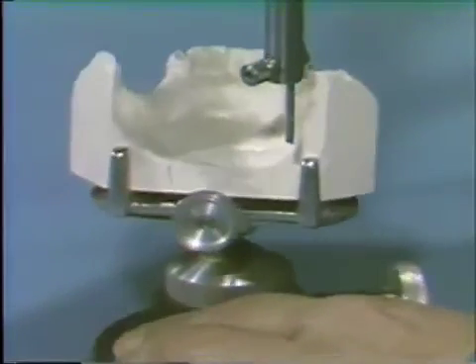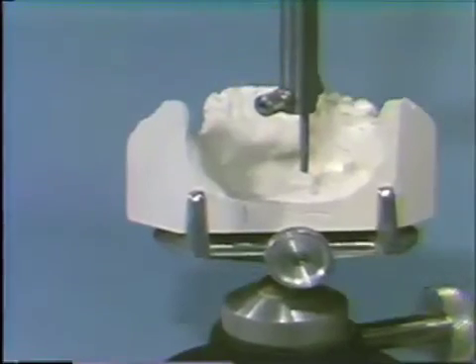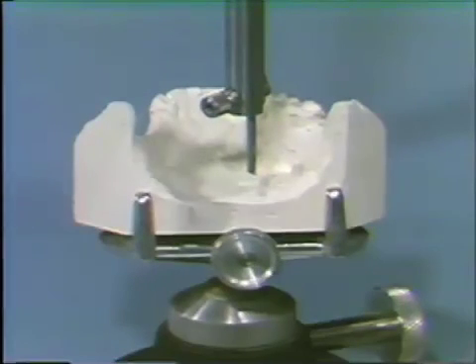It is important to realize that you can only utilize these grooves to relocate the same cast. They cannot be used for a subsequent cast made from a subsequent impression.